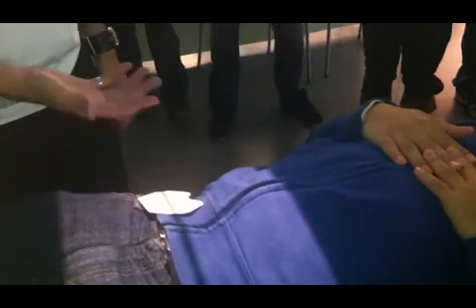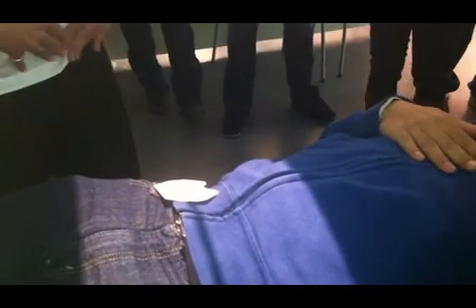Again, toes in, breath in. Make sure the shield doesn't slide off to the outside. If they have a big belly, it slides off the hip, and you've got a little problem. Most people are pretty flat against there though, so it'll stay on. What I don't want you to do is go shield.